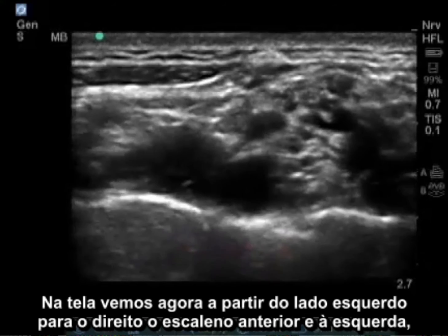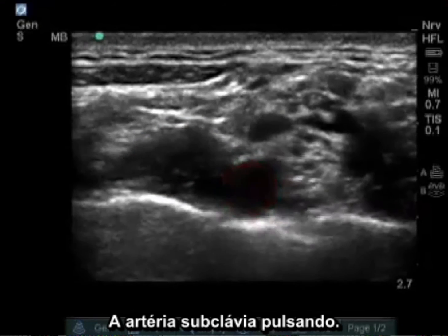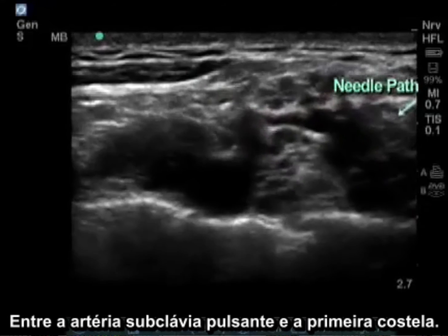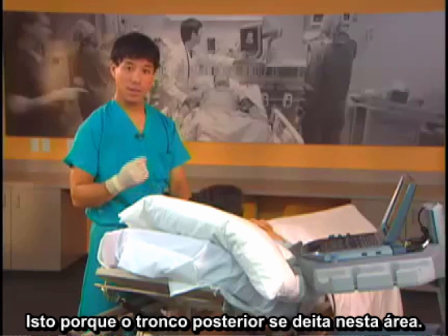On the screen we now see from left to right: the anterior scalene on the left, then the pulsating subclavian artery. The most important place to ensure you have local anesthetic is between the pulsating subclavian artery and the first rib, because the inferior trunk lies in this area.